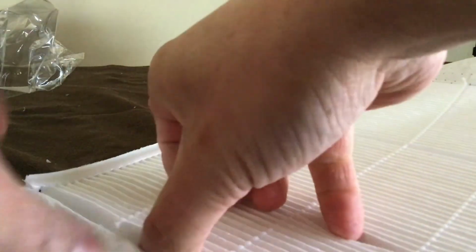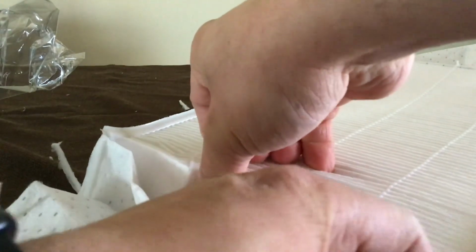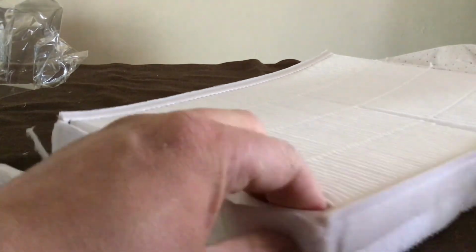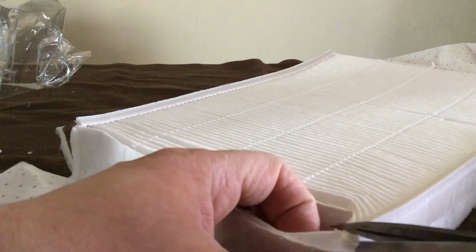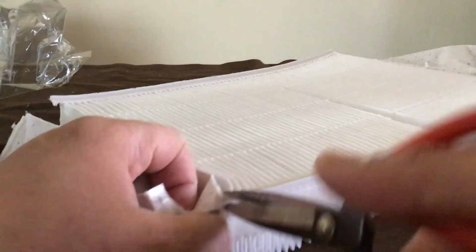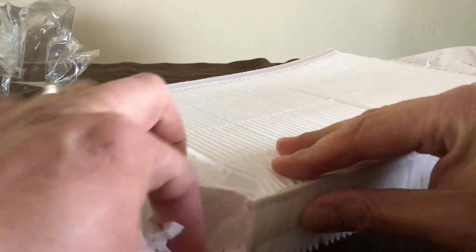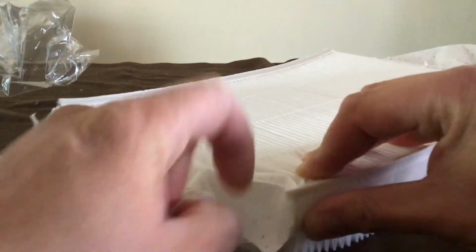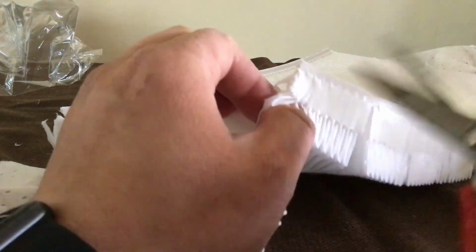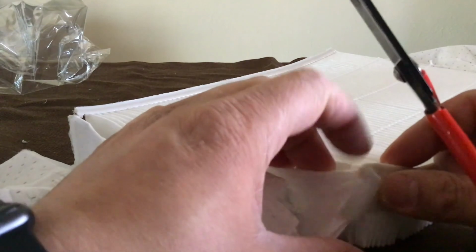Now we just start pulling apart these bits of adhesive that are holding the individual pleats together in place, while also trying not to tear too much off of the material itself. This can also be accomplished by going in with the scissors and carefully cutting through the adhesive at the edge of each pleat, like so. But I find pulling to be slightly easier. If we come in with the scissor on the side here, this looks like it'd work even better.